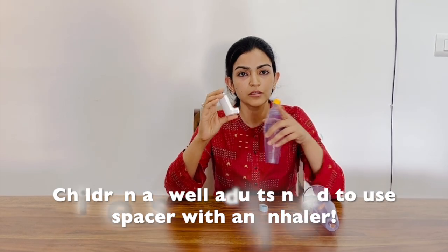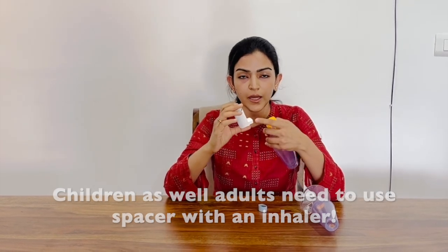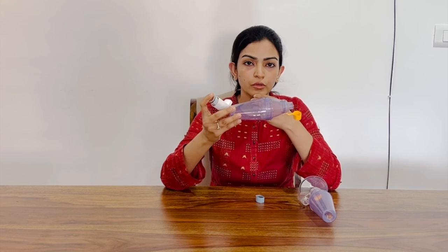When we puff an inhaler, the medicine comes out in the form of particles. Some of the particles will get deposited in the mouth and the throat, and some of the particles will go into the lungs. Our aim is to ensure maximum delivery of the particles into the lungs. This is where the spacer comes in. It helps in allowing most of the drug to go into the lungs, and it lessens the deposition into the mouth and the throat. And it also improves the hand-mouth coordination so that the entire process of using the inhaler becomes easier.